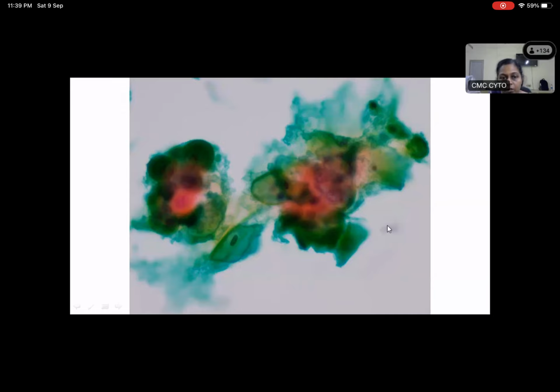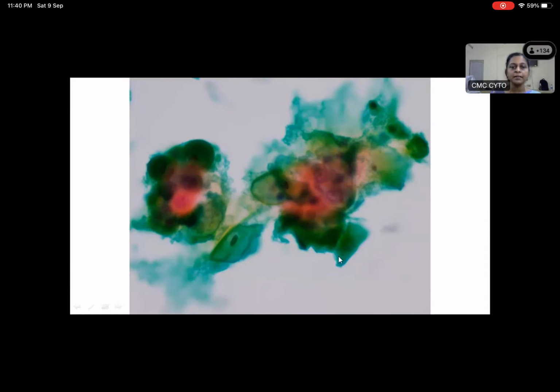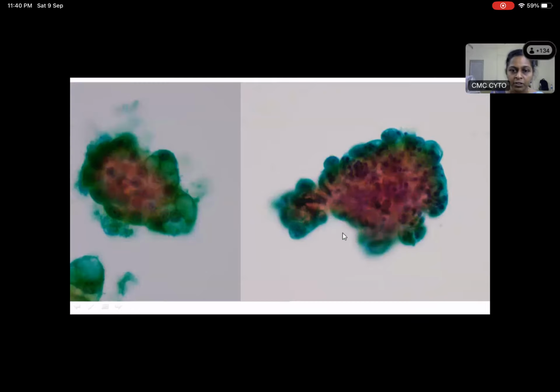So here also, what do you see? What kind of a pattern are you seeing here? Acinar pattern, ma'am. Yeah, so you're seeing an acinar pattern, and there is prominence of nucleoli also, which you're seeing here. Again, sort of similar thing, but what is different here? What is inside all these cells? Neutrophils. Yes, very good. So is there any specific name for this appearance, Pratik? A bag of polys. Very good. So that is a bag of polys.